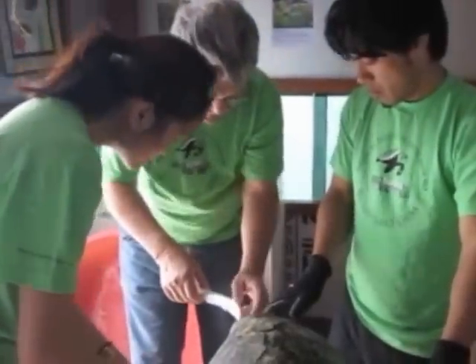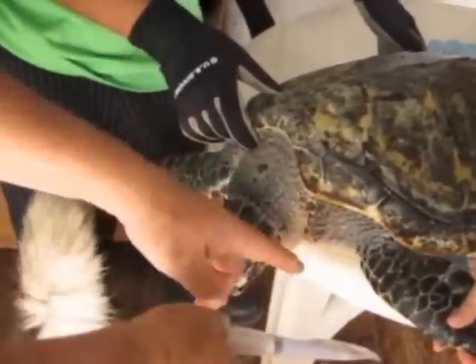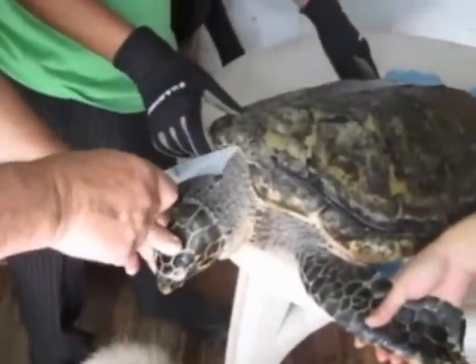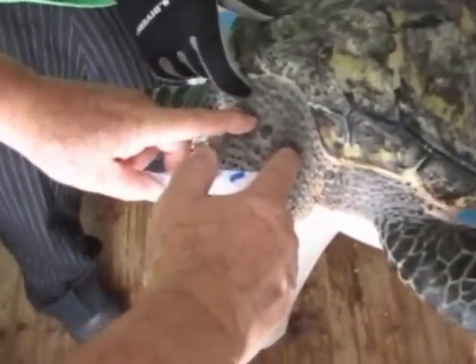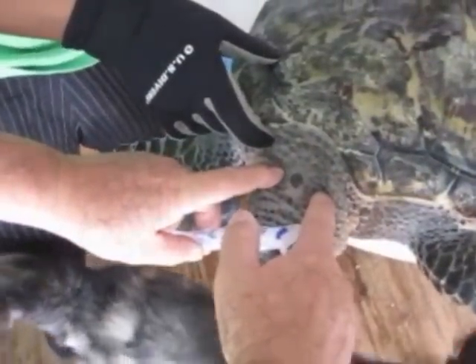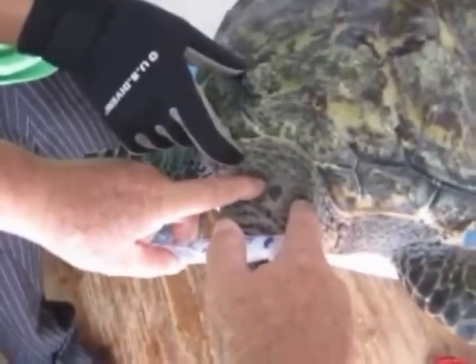You'll see the two lines — they're about right through here, but you can't see them here. The point is, you want to be outside. You can either be on the right or on the left. You normally don't want to be right in the middle because it's a less likely place. That's the area where you're first going to insert the needle, and you realize you cannot see any veins or anything in there.